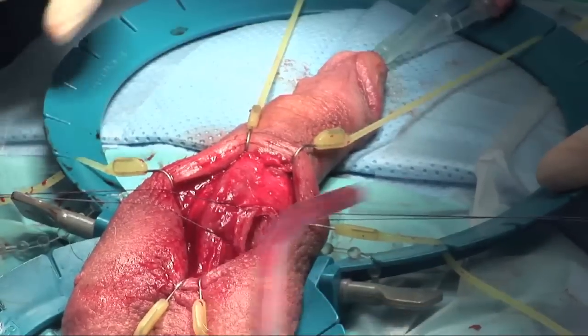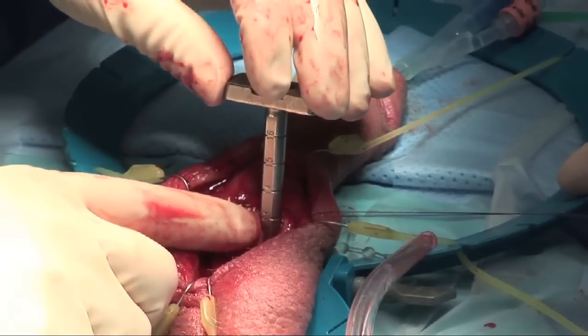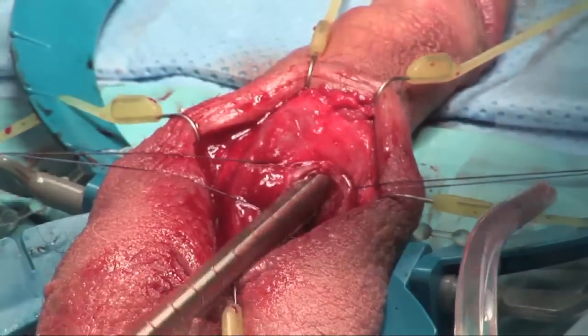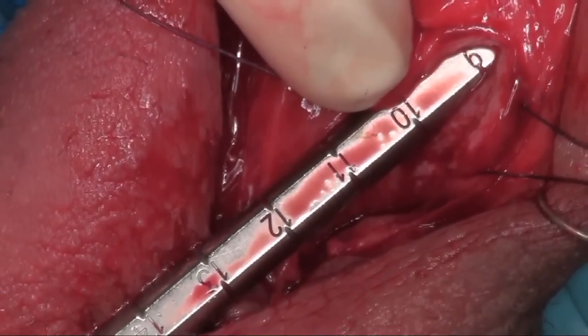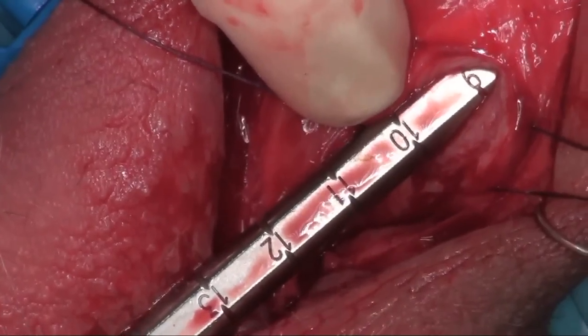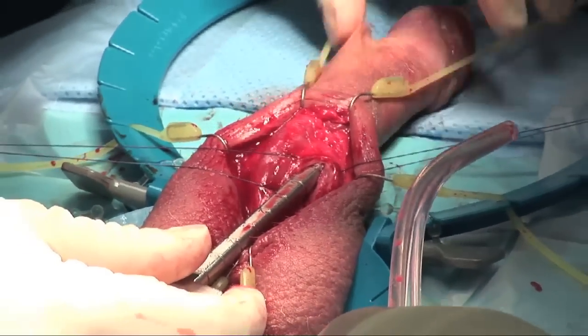I'm going to measure. If they don't have Peyronie's fibrosis, or it's not a revision, you can be a little aggressive in your sizing. And there I sized to the middle each way. This measured 24, so we're going to put in a 21 plus 3 size device because he was more proximal than distal. Once again, even when measuring, I'm staying lateral.